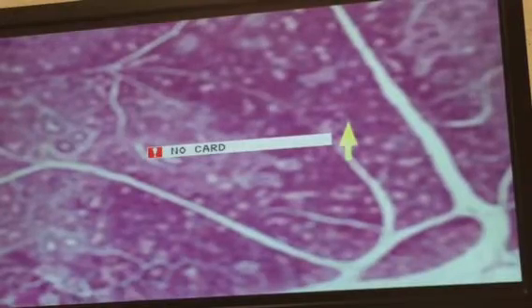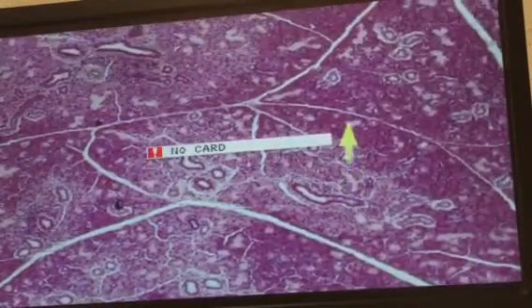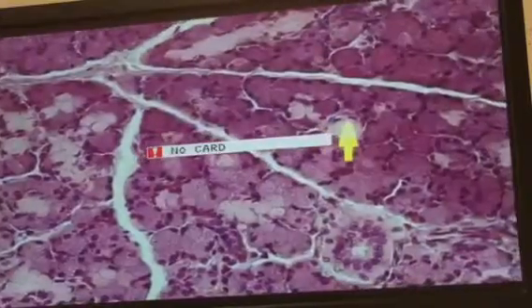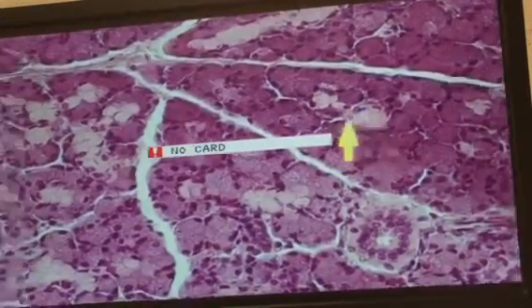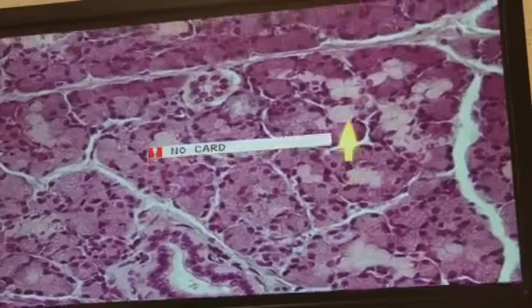And this is also submandibular gland. This one we see a few more mucus acini. Right there. And now you won't always see a nice serous demilune. But sometimes they're not even very crescent shaped. But that's what we have right there.